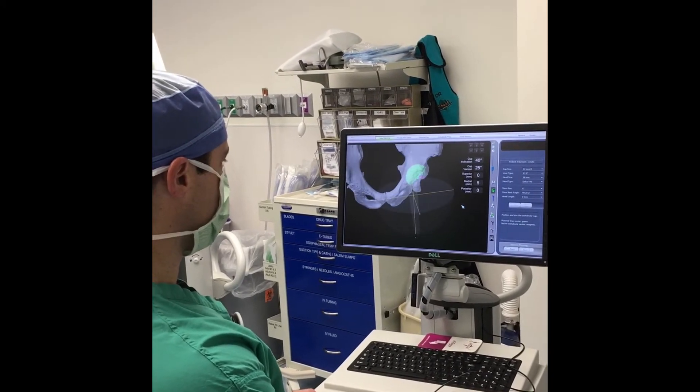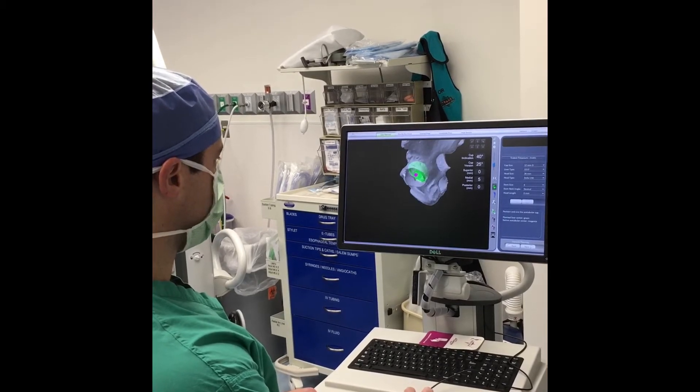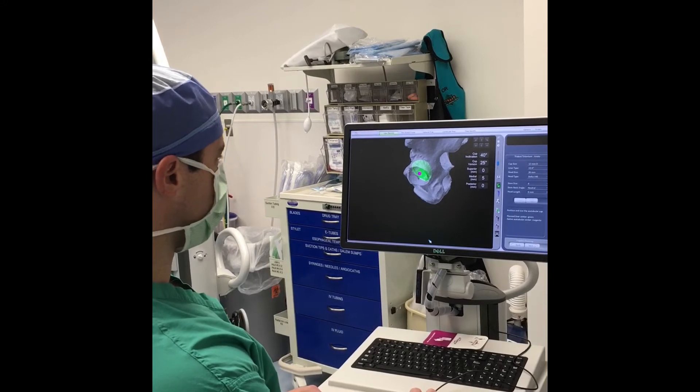I'm able to move this in all planes and look at the image three-dimensionally in relation to the patient's pelvis. I can see that he has a lot of osteophyte or bone spur that I will need to remove during the procedure.